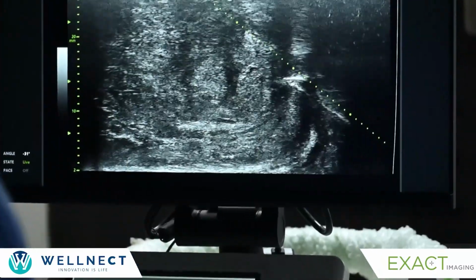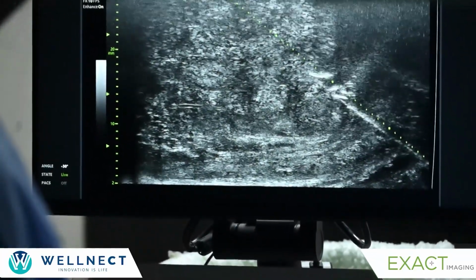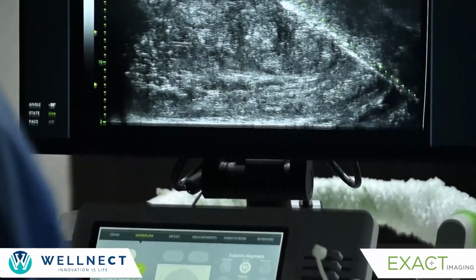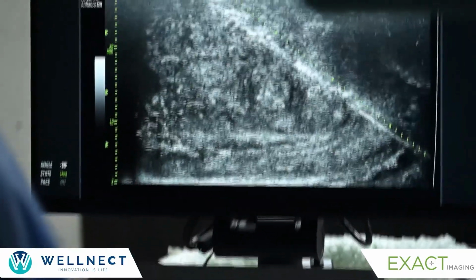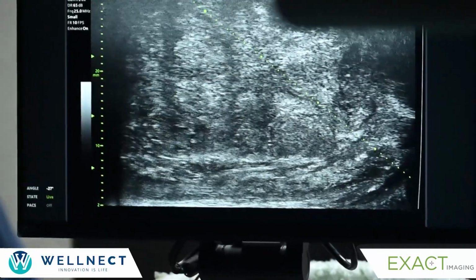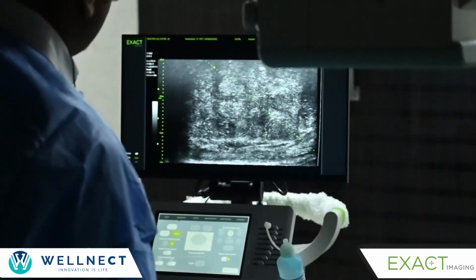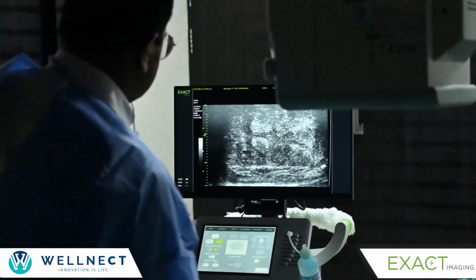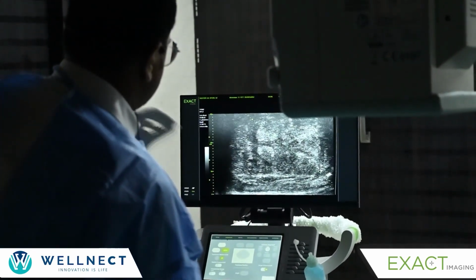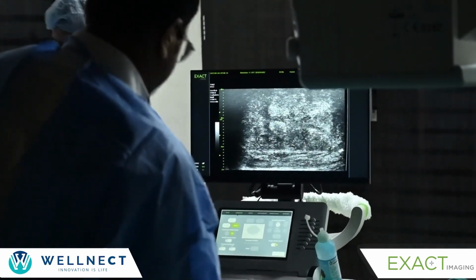So I go here. Always tell the patient, if you hear a sound, you should not be afraid. You see, can you see this mark? Yes. And for the residents, why is it hyperechoic? Can anybody tell why this tract is hyperechoic? This tract is hyperechoic because there is a small amount of bleeding that happens along this tract. That is why this is always hyperechoic.